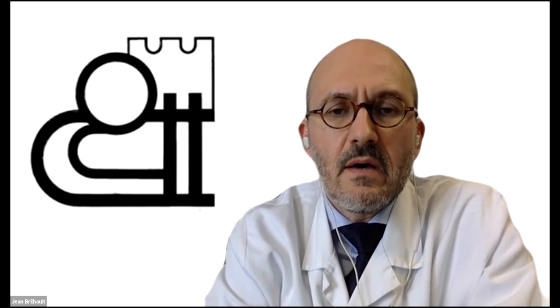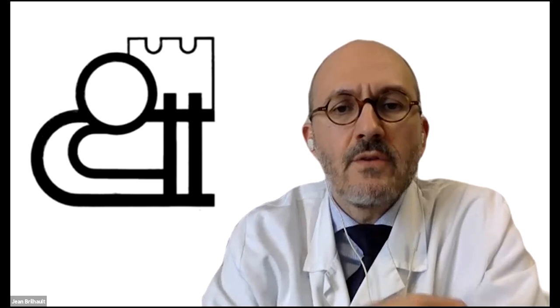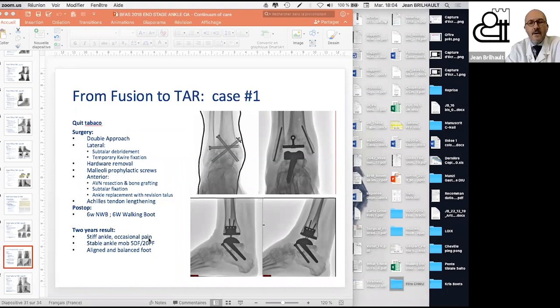I agree. I'm not so comfortable regarding the fine tuning of the rotational positioning of the ankle whenever there is a fibular deficiency, and that's the only real issue I have. Whenever it's minimally invasive or arthroscopic, you don't have this issue at all. So I do agree with you, and I think that it is even more useful when used with arthroscopy than when it's used open. But you will agree, and I will share my screen with you guys if you don't mind. Can you see my screen here?